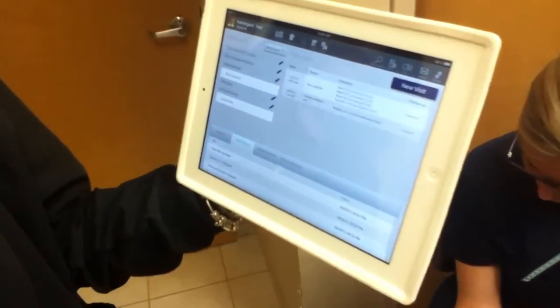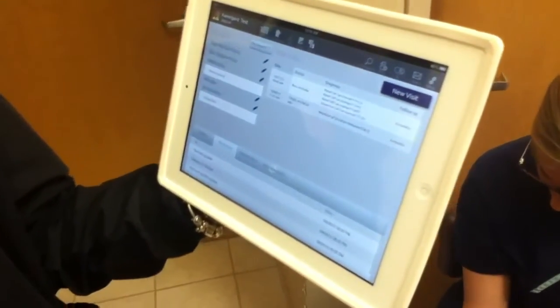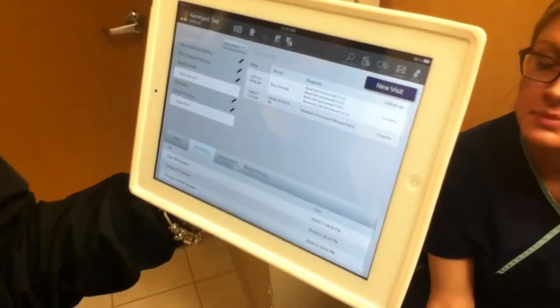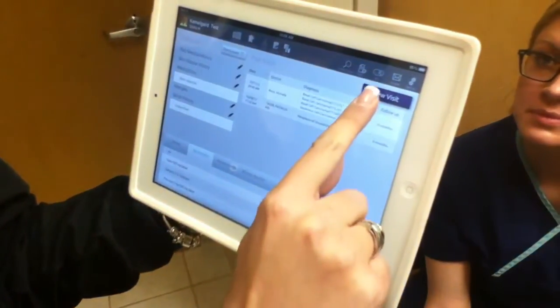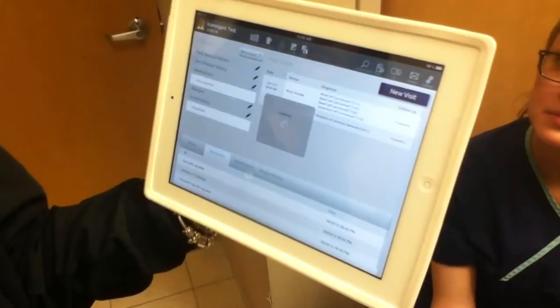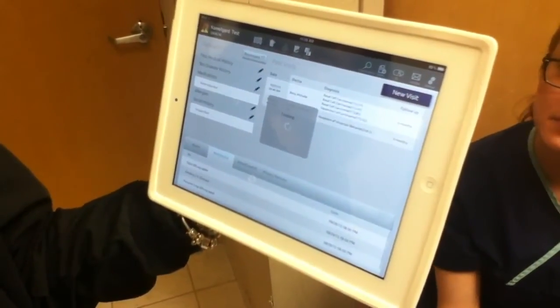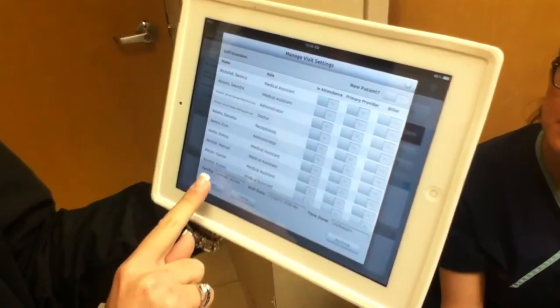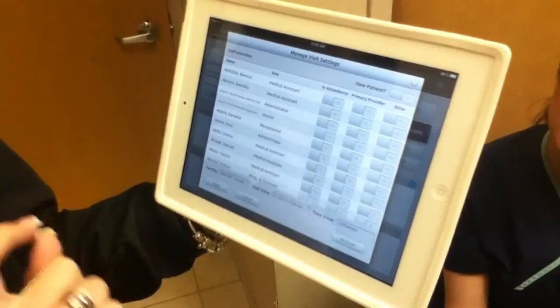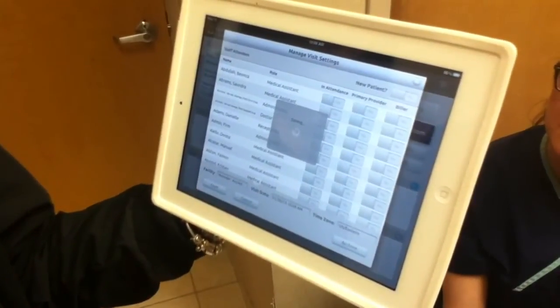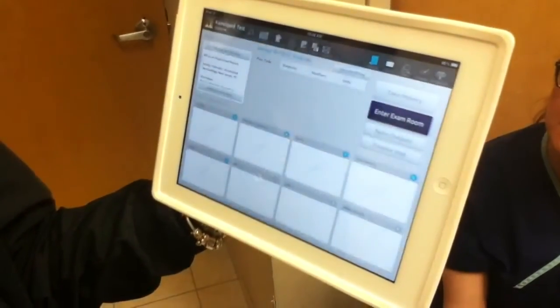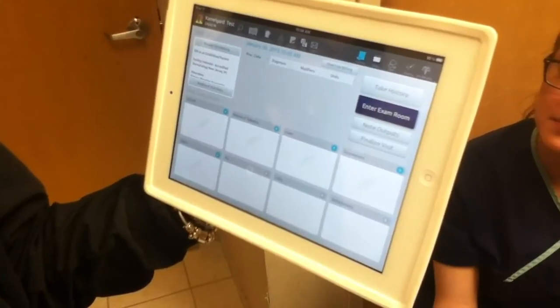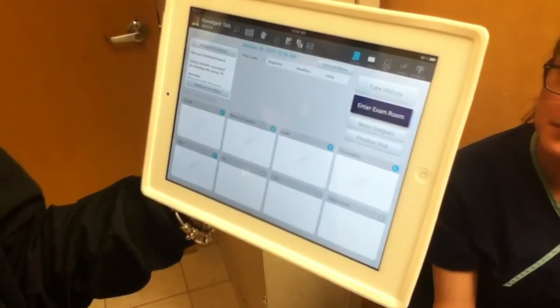Once she has the main screen, she's going to go to the upper right-hand corner and press New Visit, put in the parameters, which we're going to skip at this point.